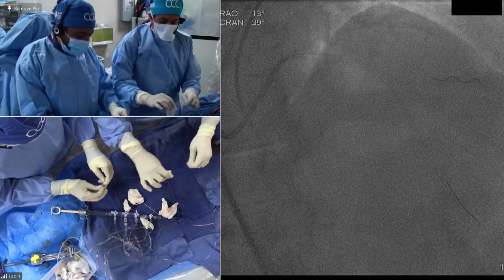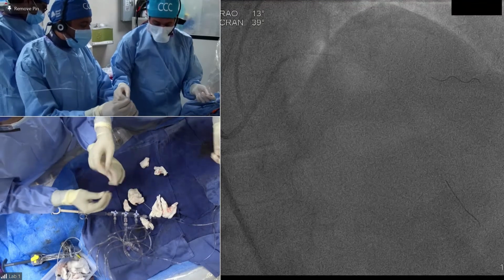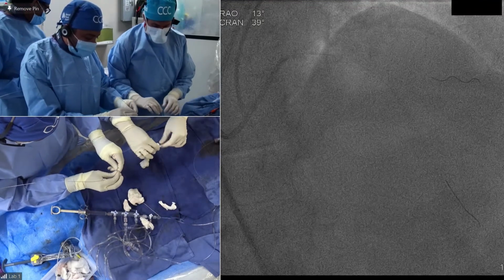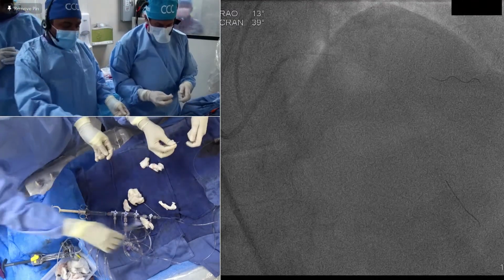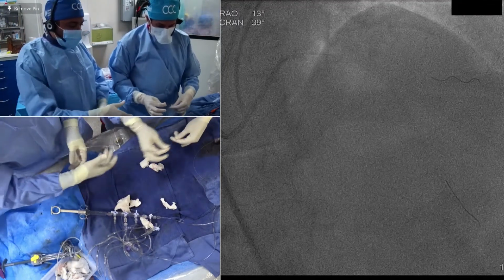Let's ask the panel, what would they do? A 2-stent strategy or balloon and stent across? Well, that's real quick. Balloon. Forget the diagonal or treat the diagonal? Jackie. Yeah, I'd cut the diagonal and then stent across it. Okay, cut and stent across. Michael.